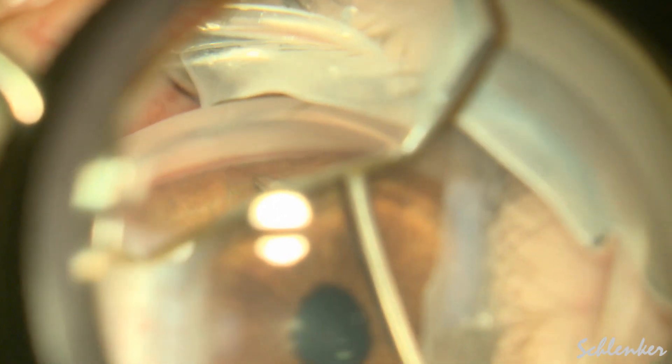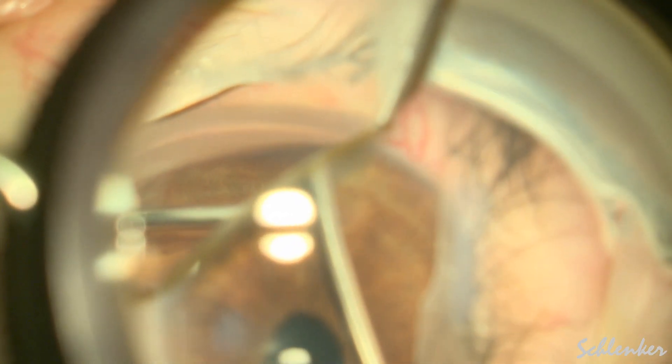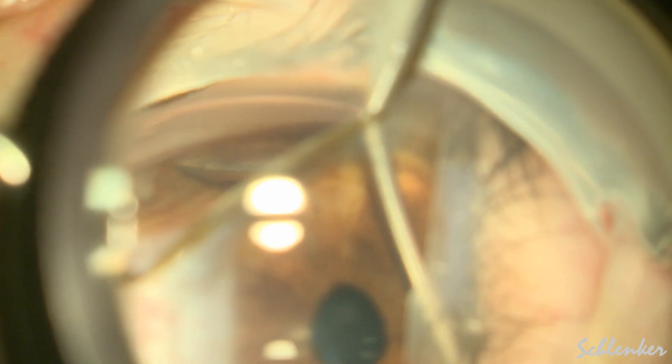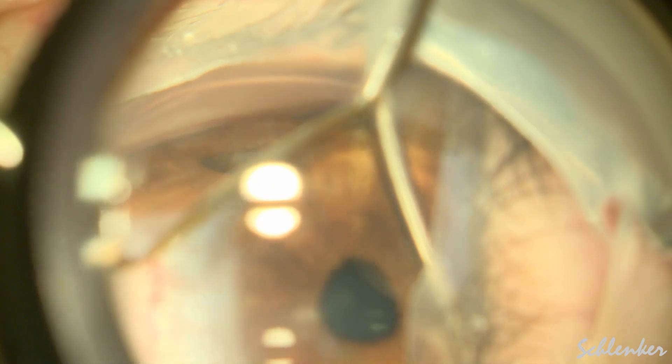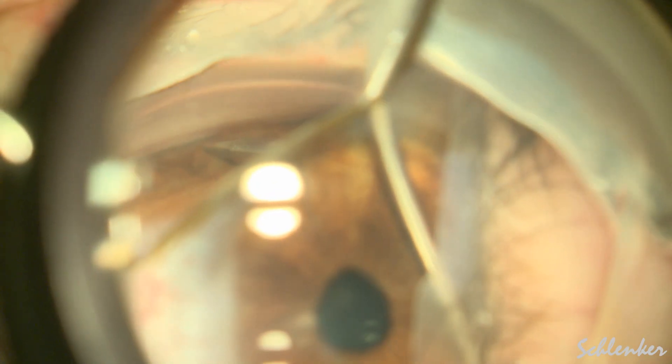In the event that the synechiae are very fibrotic and start bleeding, I generally stop. And theoretically there could be a situation where I would consider not doing the GATT and switching to a tube shunt, though I really haven't encountered ones that are that fibrotic.